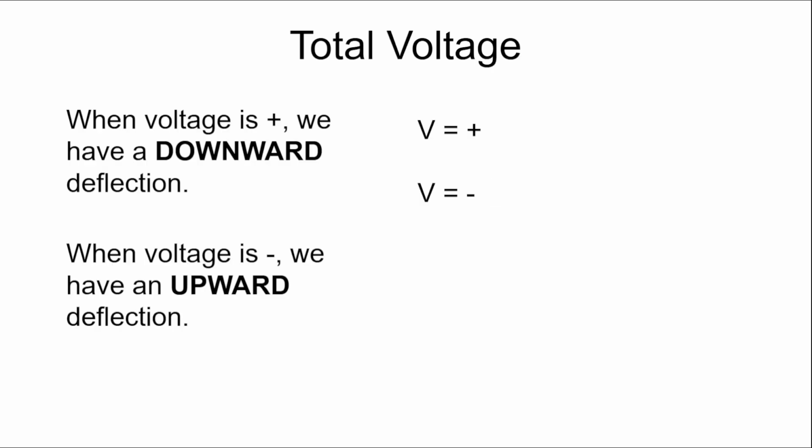In this video, we're going to discuss polarity rules. Polarity rules are oftentimes made a lot more complicated than they really need to be, as we really only need to remember one simple equation to answer all polarity rule questions. An important concept to understand when discussing polarity rules is how voltage will show up on the EEG.